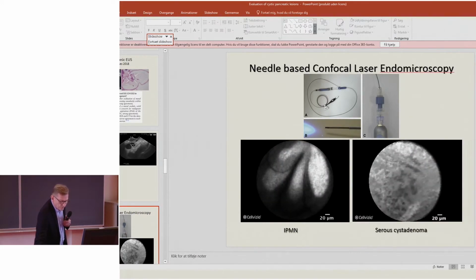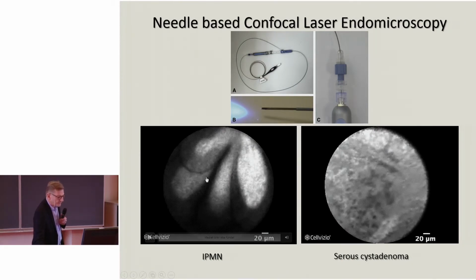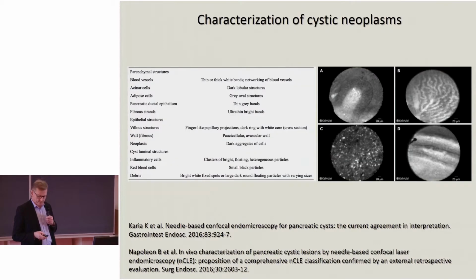Now, there are also people working on CLE. Okay, I'm sorry, it doesn't work here. But a needle-based CLE, confocal laser endomicroscopy. People have worked scientifically on this, and there is a very well-characterized study done by these authors.